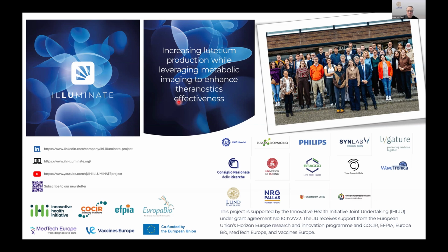But they don't know if some people do not respond at all. And that's the field, because the therapy is expensive, where MR can come in. So the idea is that with 7 Tesla metabolic imaging, using this phosphorus whole-body scan technique, looking at this marker for membrane building, the glycerol phosphates, and taking deuterium in. So again, looking at the lactate by giving the patients glucose. So you're looking at the lactate on the deuterium side and the membrane building component on the phosphorus side as a biomarker to identify patients that are not responding to this expensive therapy.